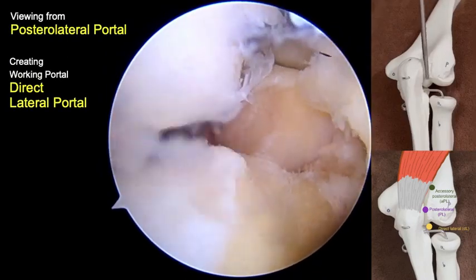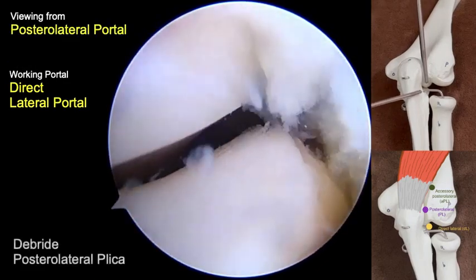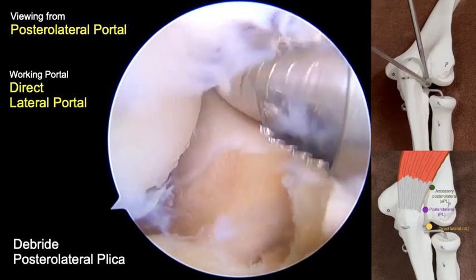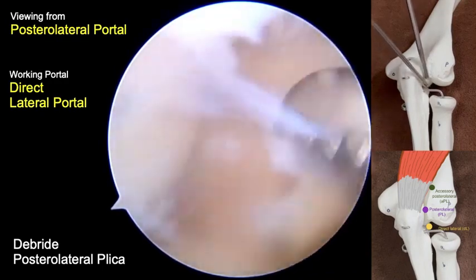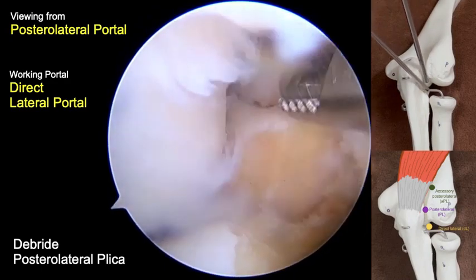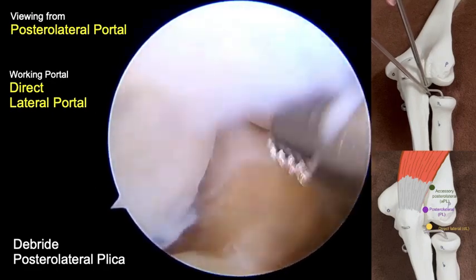A direct lateral portal was created as the working portal. At this setting, the plica can be easily resected at the area of the posterior radiocapitellar joint. Working is easier with the elbow extended.